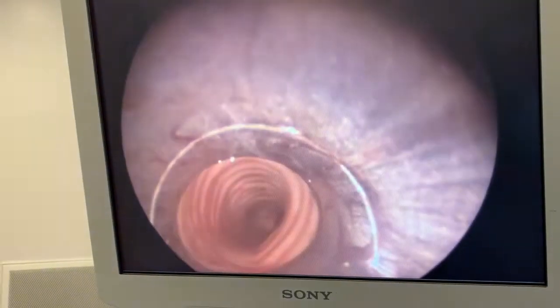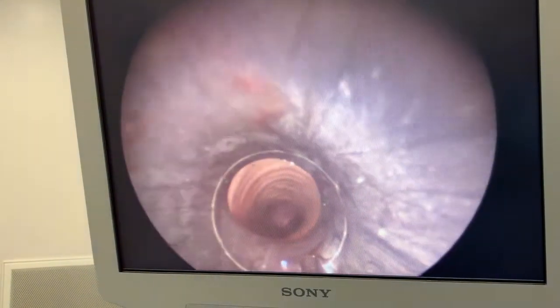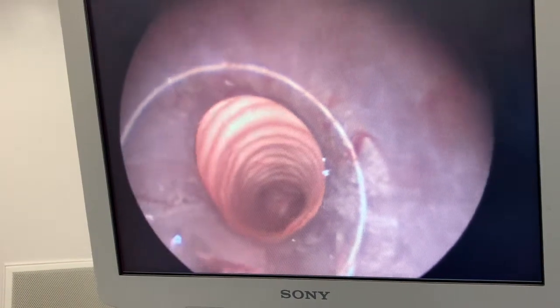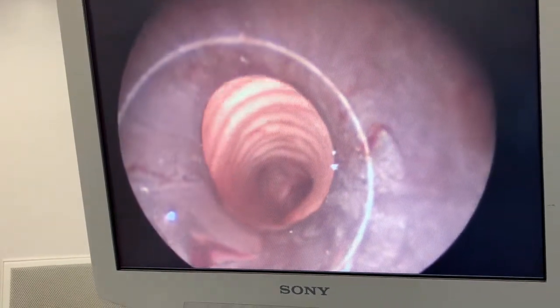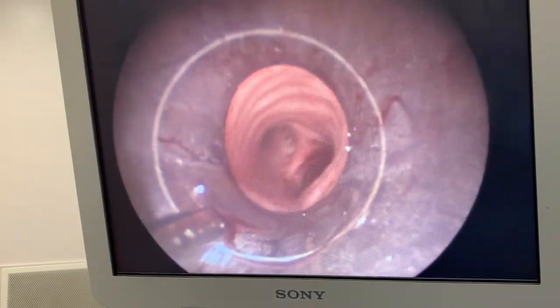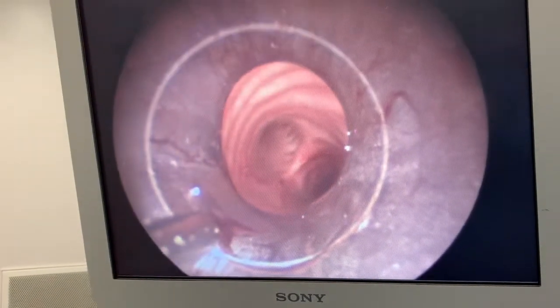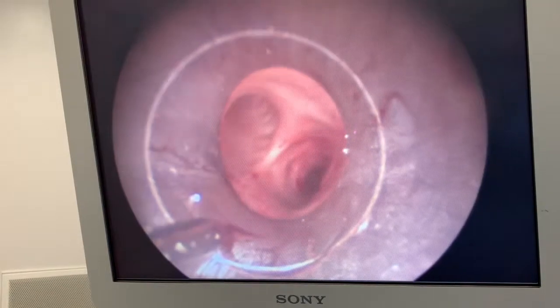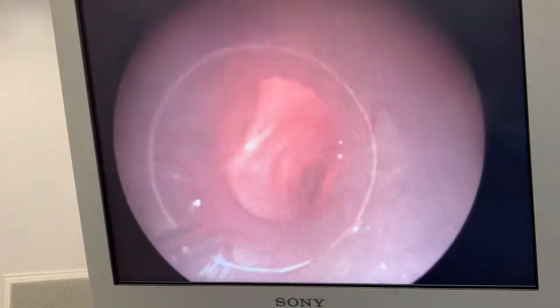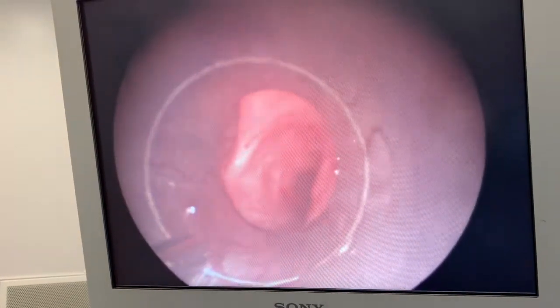Then we go through the cords. Once we're through the cords we rotate another 90 degrees so that the bevel of the scope is aligned along the posterior wall of the trachea. You can see we're in the trachea there, advancing down to the carina and the right main bronchus.